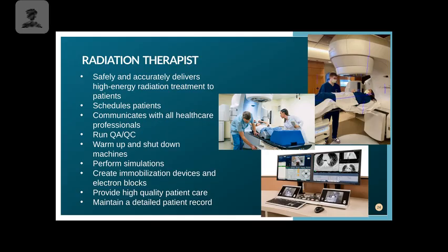Over here, we are going to have our treatment console. So we sit behind here. That is our daily place to sit. We will monitor the patient through the audio visual, and then we will also deliver the treatment. We will do our imaging prior to that, ensure everything lines up correctly, ask the physician if we have any questions, all those things. Here we have a couple pictures of setup.